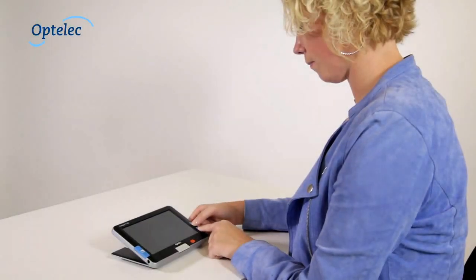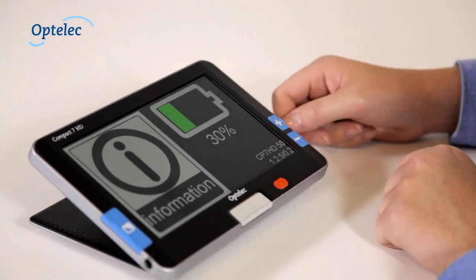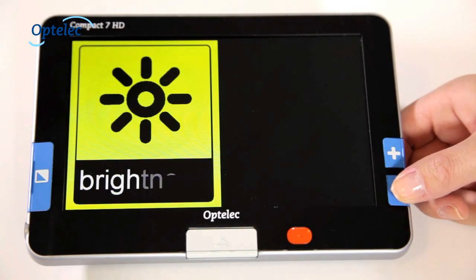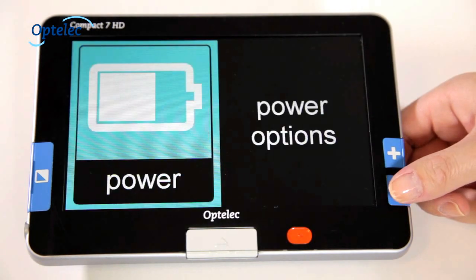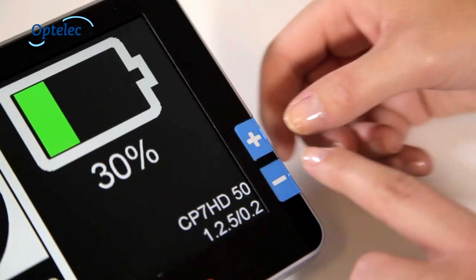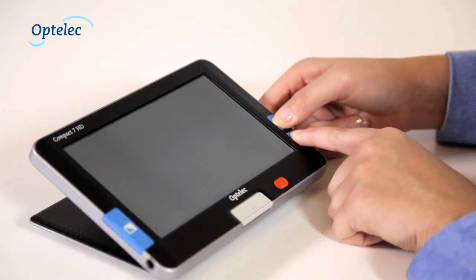The special menu, which has been optimized for use by the visually impaired, allows you to adjust each setting to meet your needs. The settings are displayed as high contrast icons. Simultaneously press the plus and minus buttons for at least one second to activate the menu.